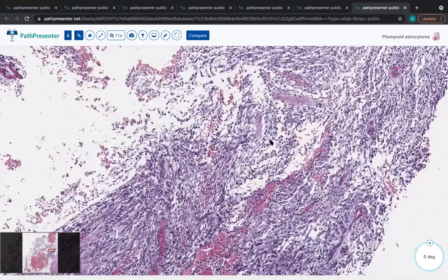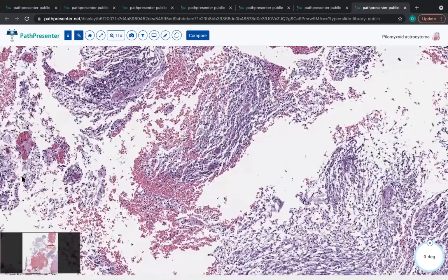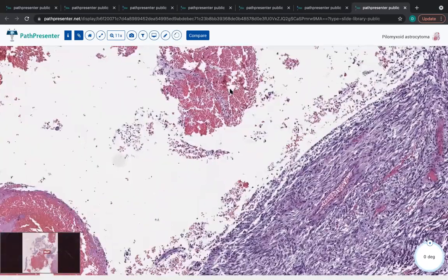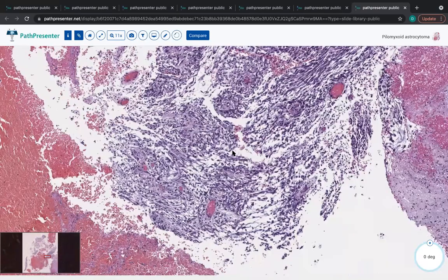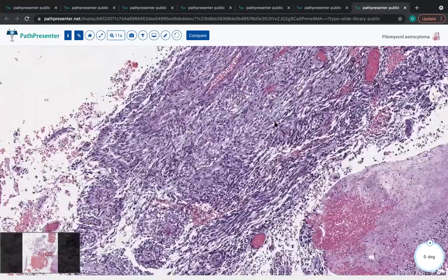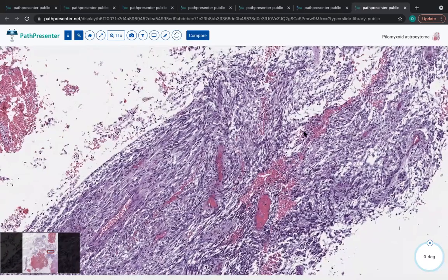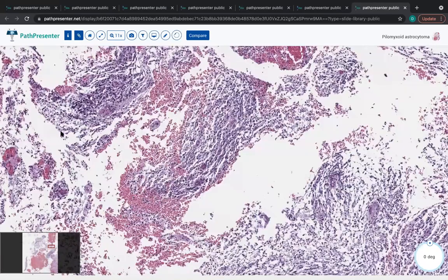Okay, so that, of course. Next, what I wanted to show is the close cousin of a pilocytic astrocytoma. One may read about a pilomyxoid astrocytoma. These are far more rare, and they tend to be much more localized to the hypothalamic or suprasellar region, those that are kind of in the quote-unquote optic pathway region. And as I just gave you a broad overview, you'll notice that it shares many similarities with pilocytic astrocytoma.